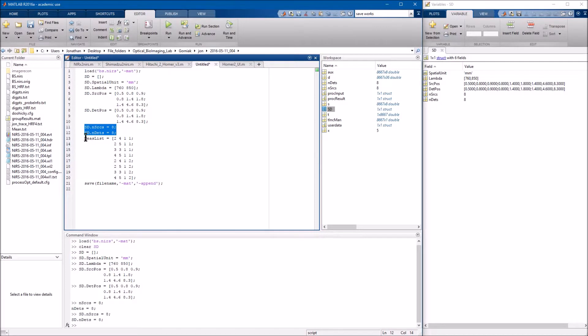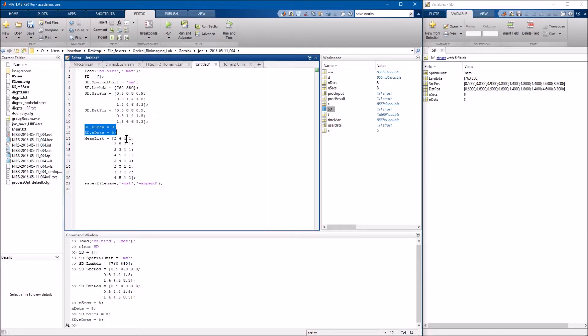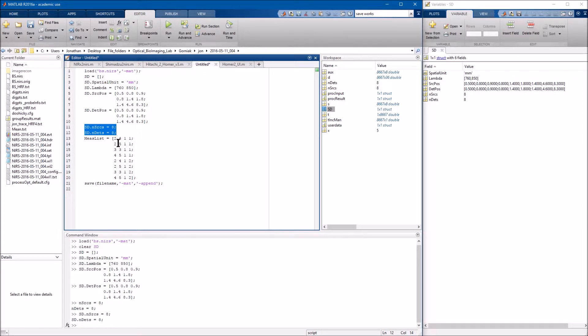And then we finally have our MeasList. The MeasList is a little screwy in appearance. But all it is is the collection of sources and detectors that you consider a channel. And that's going to be per wavelength. So here we have source two, detector four. The third column is actually all just ones. And the fourth column is your wavelength. So it's source two, detector four, wavelength one. Source two, detector five, wavelength one, et cetera.